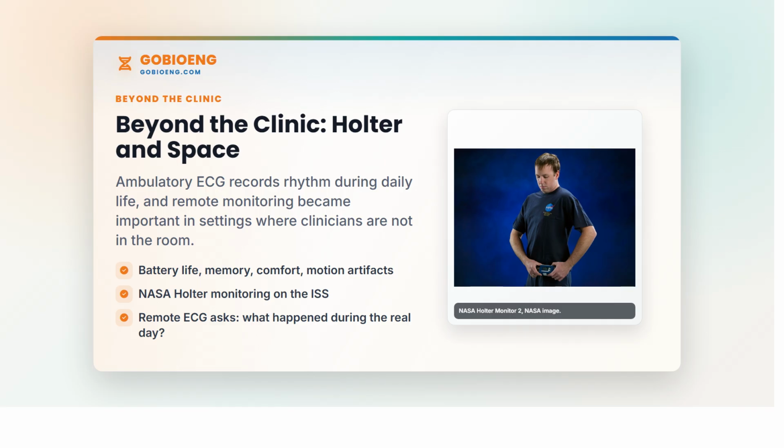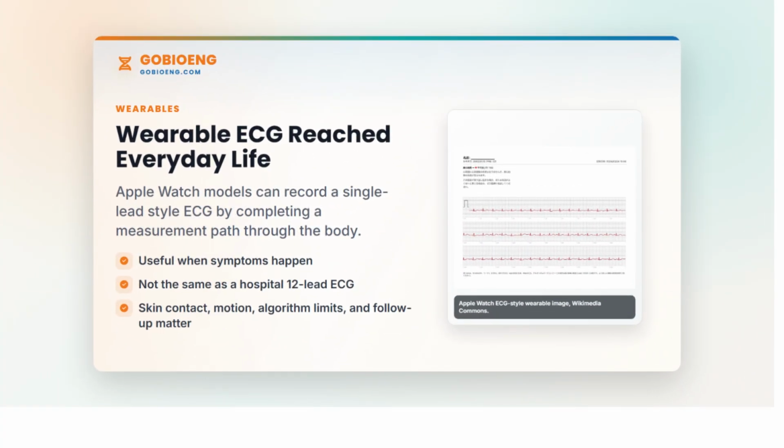Consumer ECG is still biomedical engineering. The device may look simple, but the fundamentals remain: electrode contact, signal acquisition, filtering, interpretation boundaries, user instructions, data presentation, and escalation when symptoms are important.